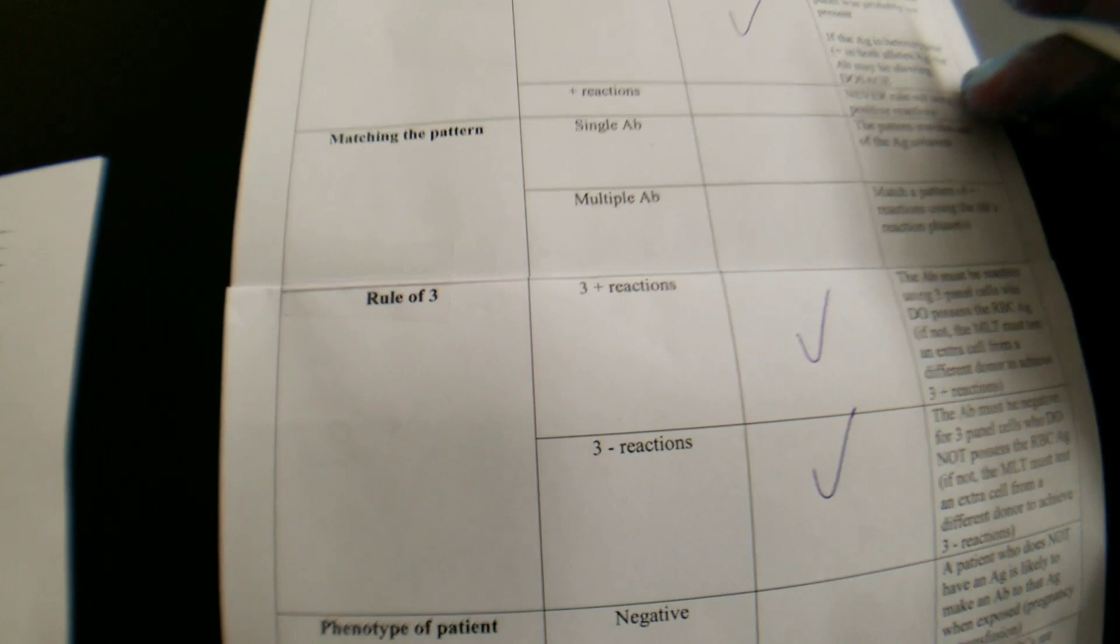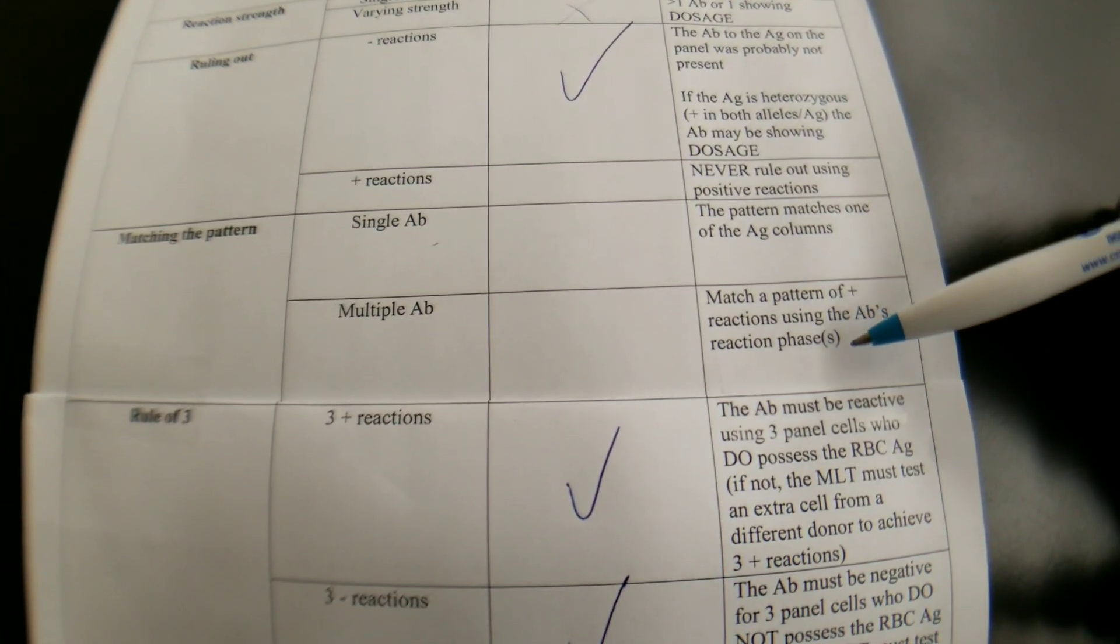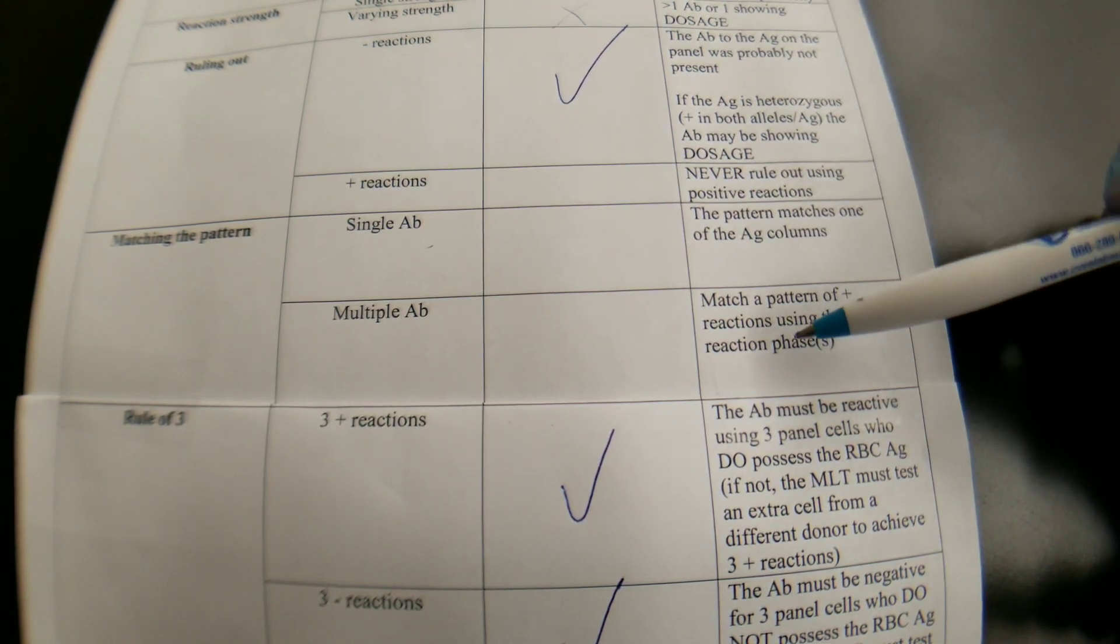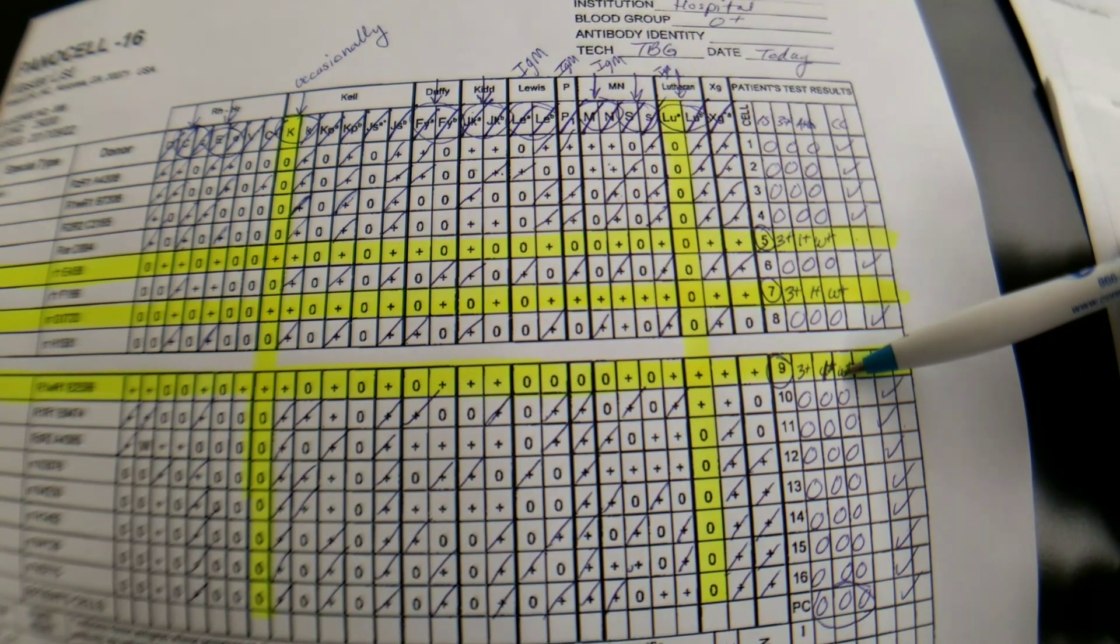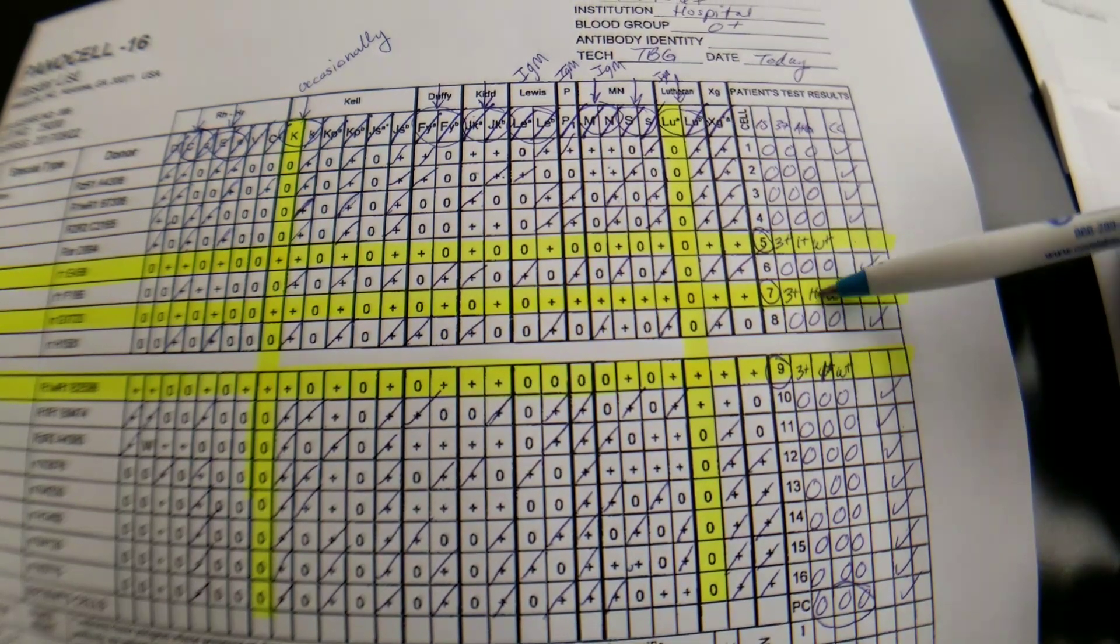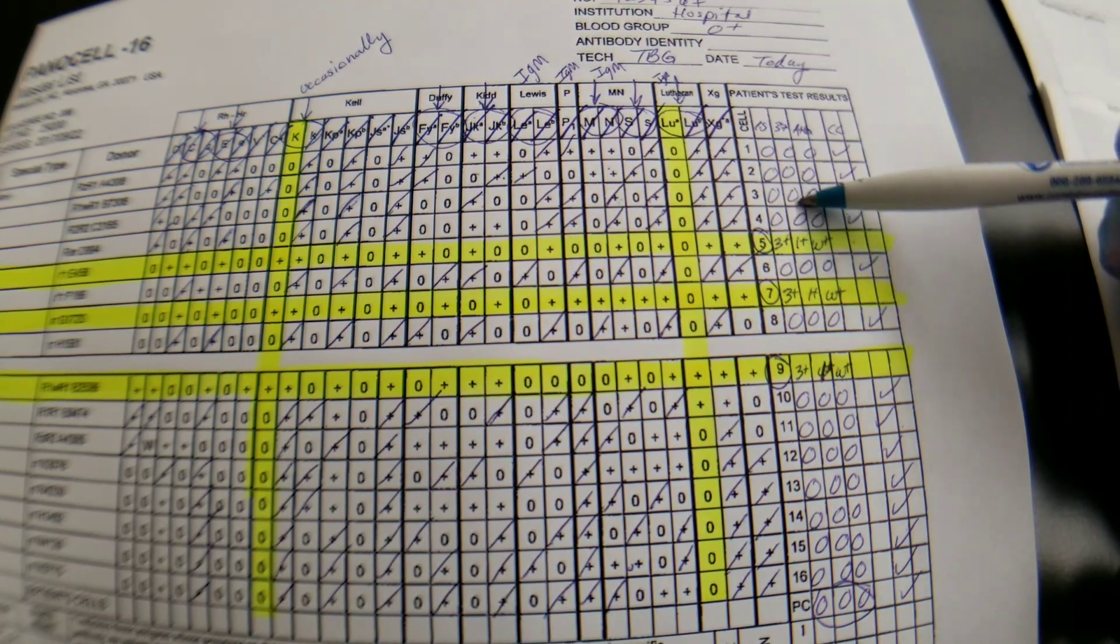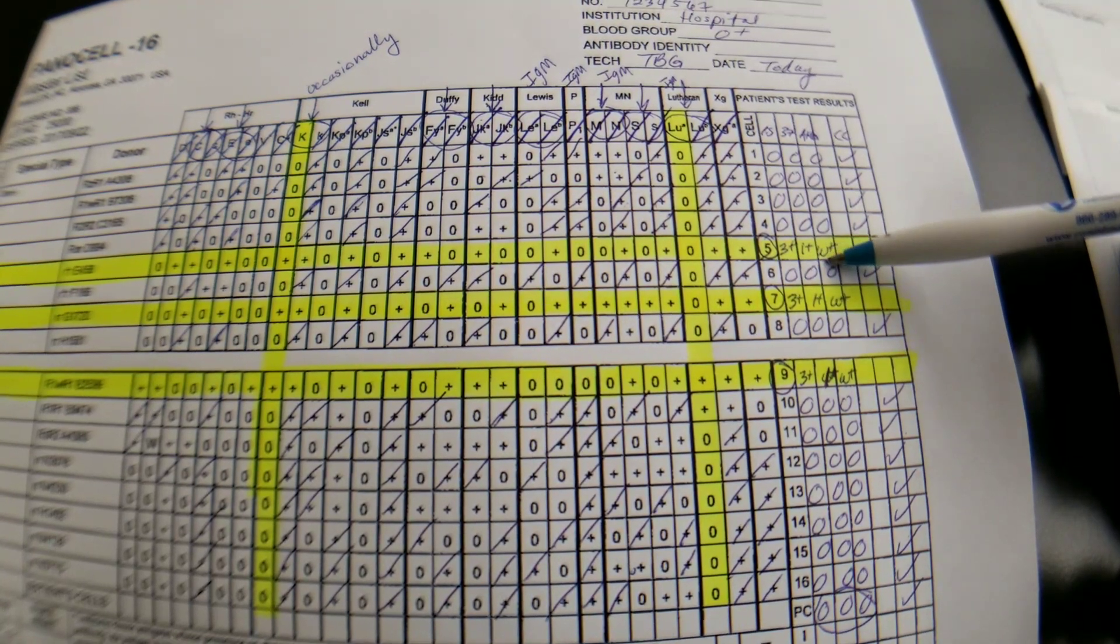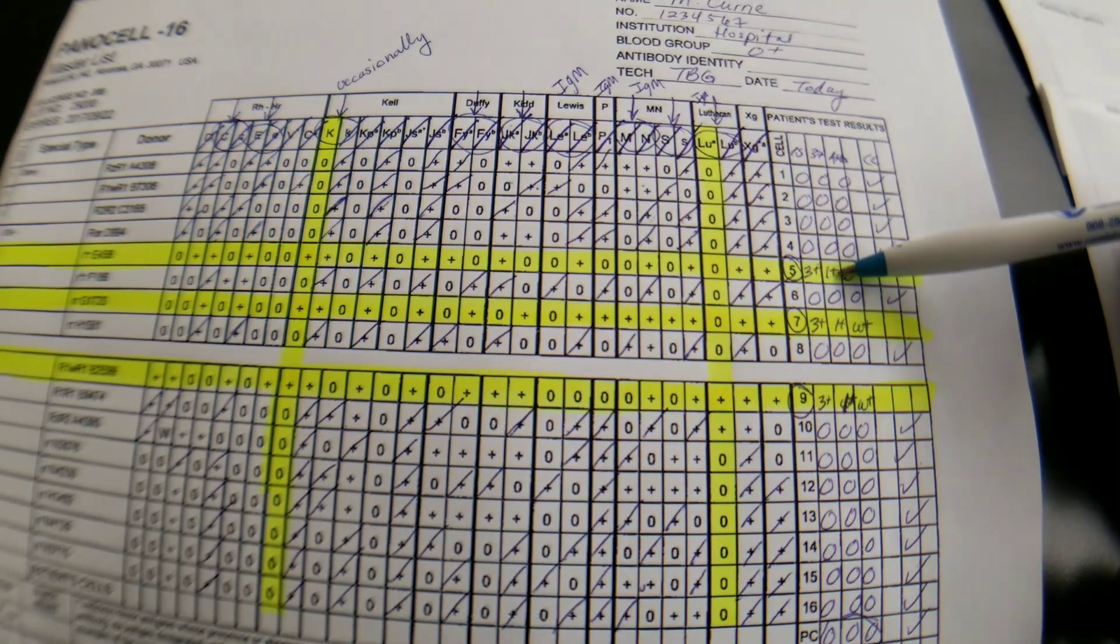Okay, let's do the pattern now. All right, with the pattern, it says single antibody. The pattern matches one, or a multiple antibody. You match a pattern of positive reactions using the antibodies' reaction phases. Okay, we said that we think we have one antibody because they all look the same. And I'm going to stick with that. Okay, when you have varying reaction phases, it would mean that maybe you have fours and threes in here, threes and ones in here. Okay, so you would have different reaction strengths that don't all match one exact pattern like these do. So I keep saying pattern, but you know, reaction phase pattern.